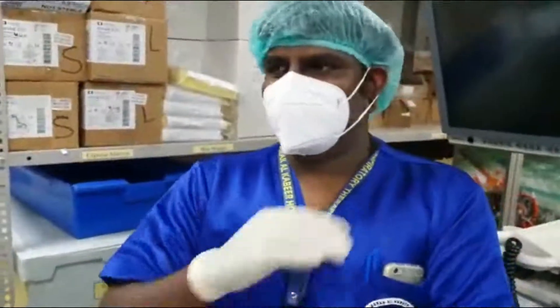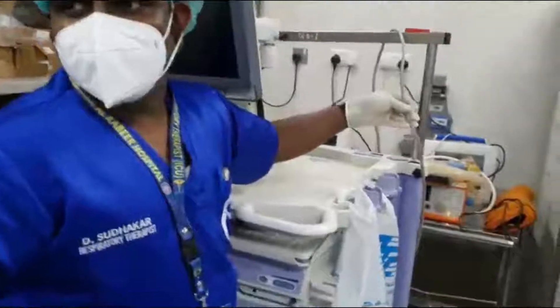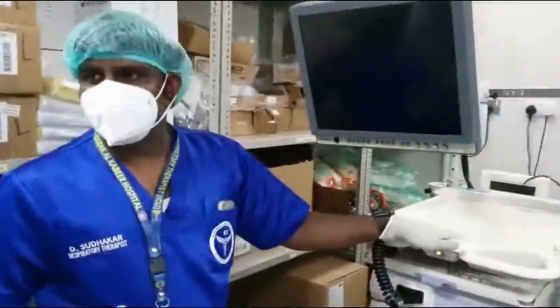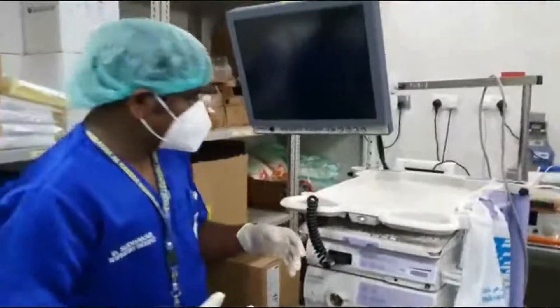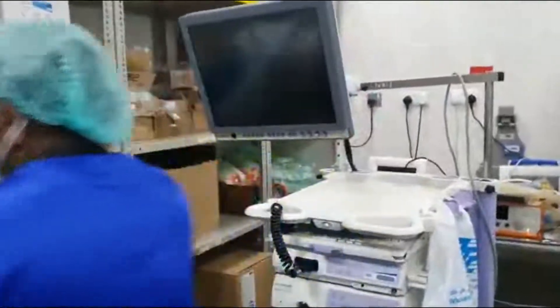Then we have the power button and the power plug — we have to connect it to the power point and switch it on. The indicator shows the machine is connected to power. Now we have to connect the machine to the scope. I will show you how.